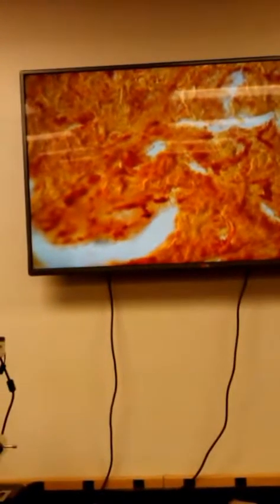So what you walk away from here is that it's not near as organized. It's just every which way with some gaps here and there, very irregular. Doesn't offer much more than that. What is this? This is spongy bone. Spongy bone. Oh, okay. Remember it looks spongy. And so that's what it's called. Like, trabeculae.